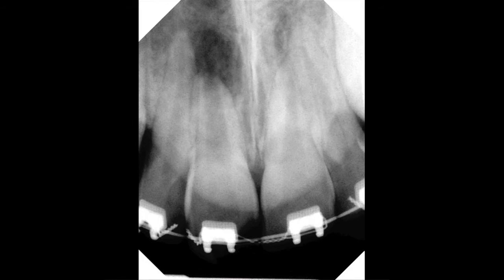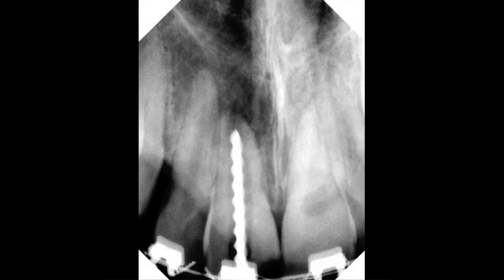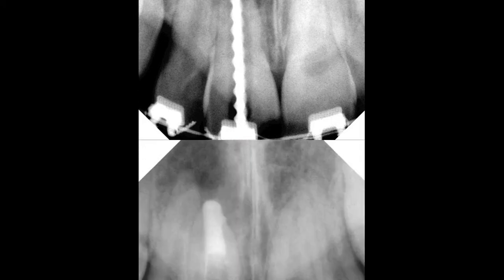In order to establish length in a tooth with an open apex, you must utilize a radiographic method by inserting a file and taking a radiograph, because the apex locator will not work in a tooth with an open apex.